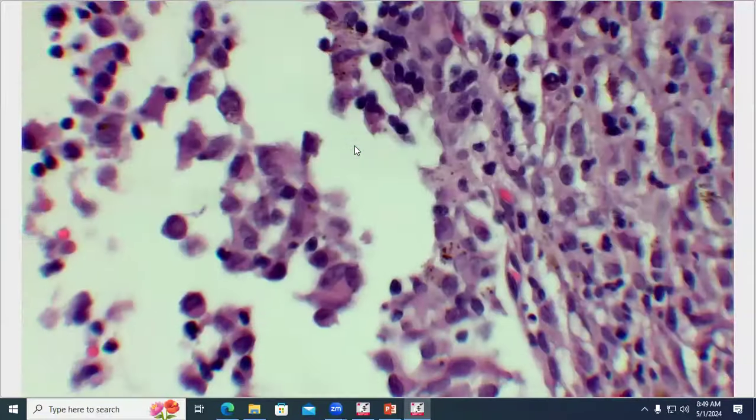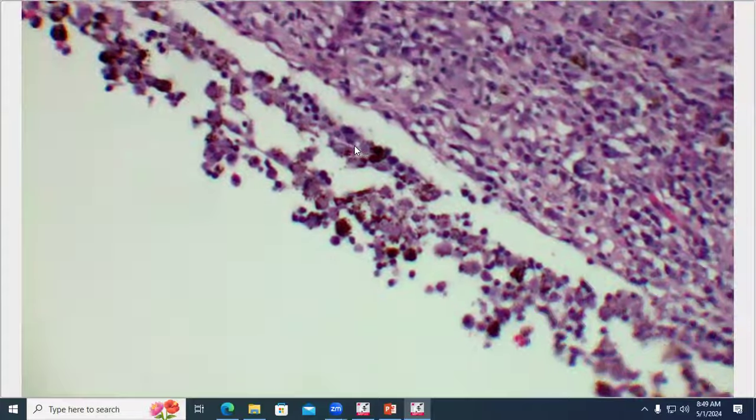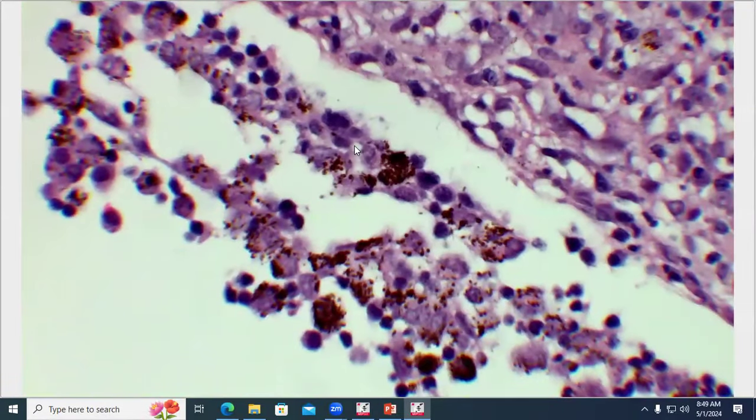Another thing that we look for is another pigmented epithelium here, the retinal pigmented epithelium, which in this case is gone, right? So I think you guys are catching up with the theme of this case. Melanin being attacked, right? And if you move farther up, you can start seeing some of the pigmented RPE cells. RPE cells are fun because they are one of the few pigmented cells that have particularly interesting looking granules. Their granules are elongated, kind of football shape.